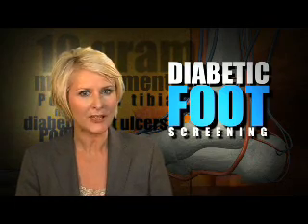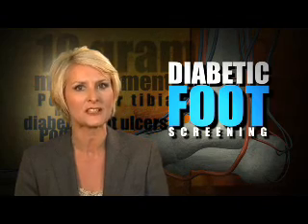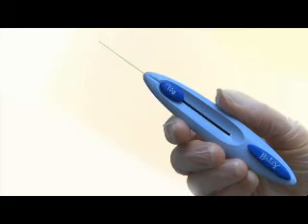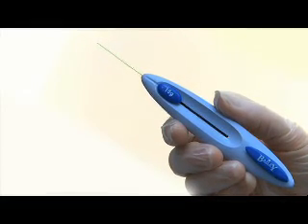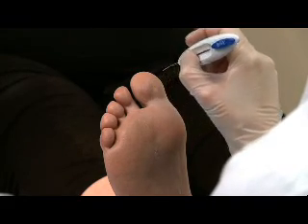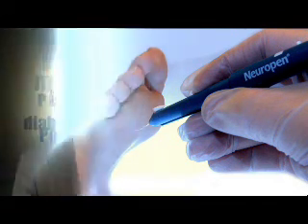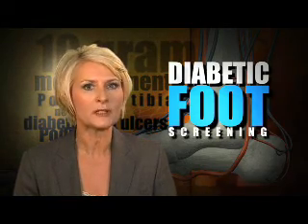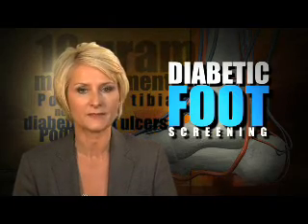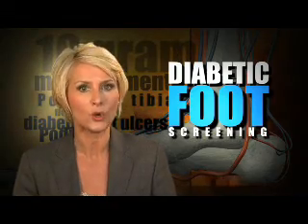The next test we carry out is for diabetic neuropathy. This is to enable us to easily check if the patient's protective sensation is intact. For this test, we use a 10-gram monofilament. It's important that you only use reputable makes of monofilaments, such as those manufactured by Bailey Instruments and Owen Mumford. This will ensure that the information you are collecting is accurate. The monofilament must be rested after use and replaced regularly, approximately every 6 months. The advantages of this test are its simplicity, accuracy and low cost.